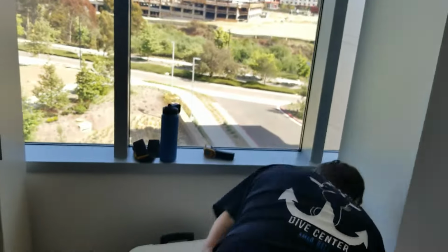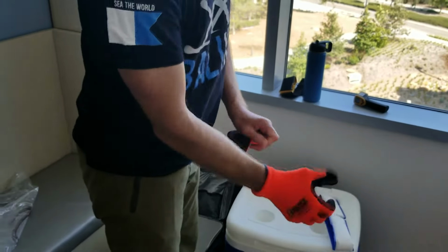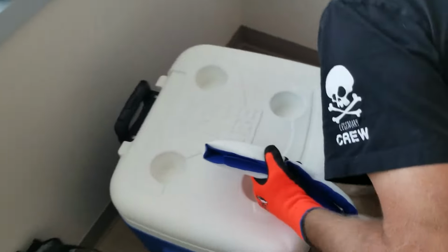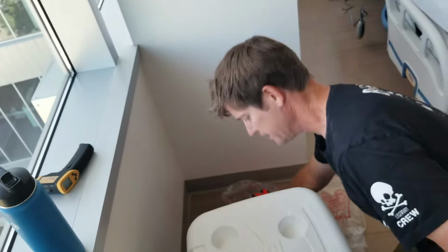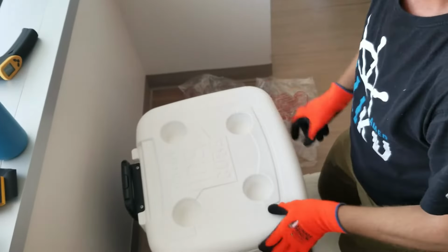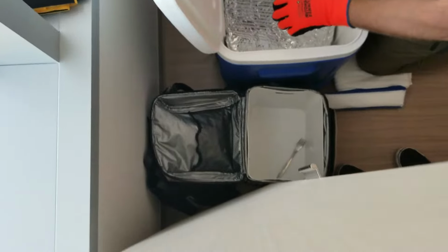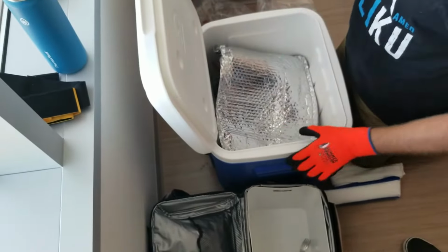So let's talk about packing the cooler up. It's dry ice, and it will burn your hands if you don't have gloves on. And it'll burn your hands if you have gloves on or don't have gloves on. Put a little pad there, and typically, like I forgot my towels today, you'll have a towel on the floor so you don't damage the floor. And open up the cooler. You'll see how the Penguin cold cap system shows you how to pack it, really labeling all the numbers and labeling it 1, 2, 3, 4.